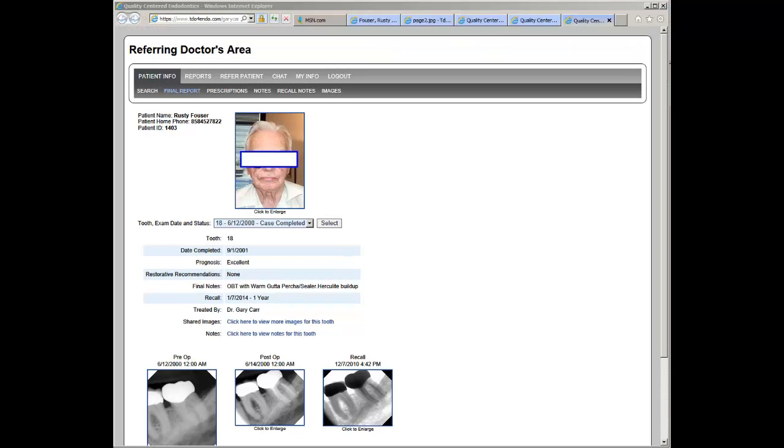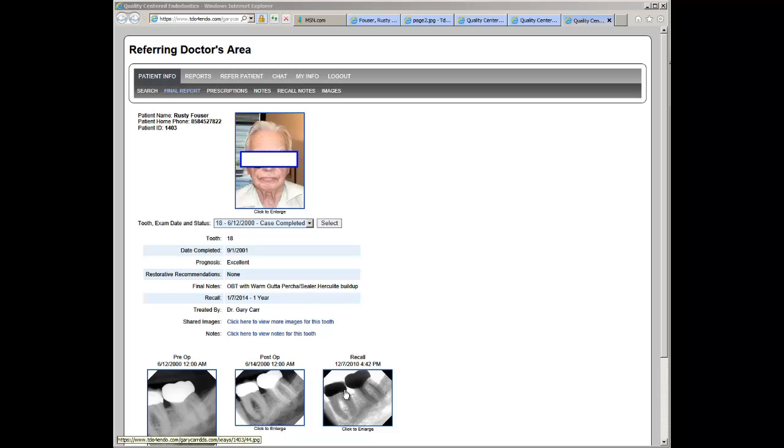The information available is the final information from the case, as well as the images. These are the pre-post-op and recall image for this case.